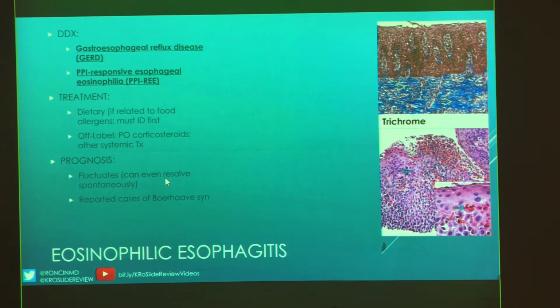I put a trichrome stain because I thought that was really interesting to see how you have your epithelium up top and then a really fibrotic, densely fibrotic stroma, and that would be related to trachealization or previous dilatation for stenosis. And then just more pictures of EOs.